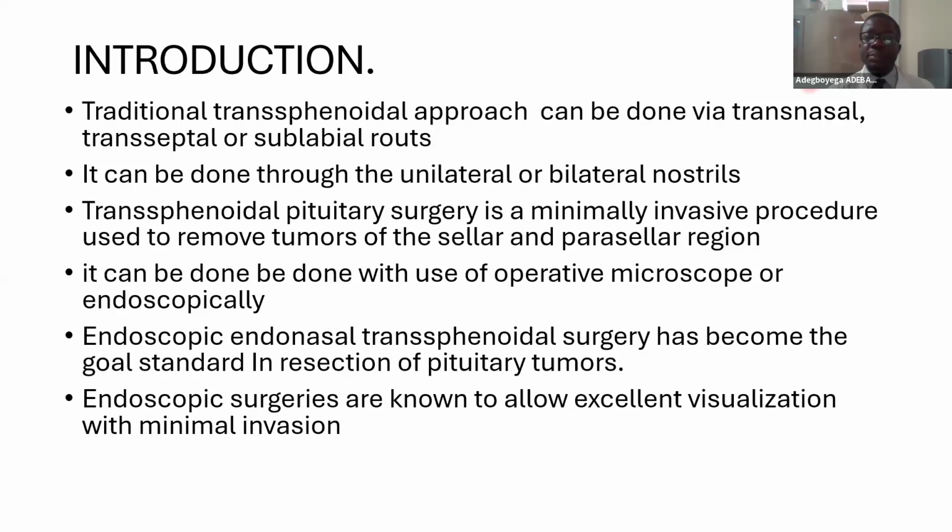Transsphenoidal pituitary surgery is a minimally invasive procedure used to remove tumors and lesions in the sellar or parasellar region. Traditionally, the approach can be done via three major routes. You can go through the nose, that's endonasally. You can go through the transseptal route or the sublabial route. It can be done with the use of an operative microscope, or it can also be done endoscopically.